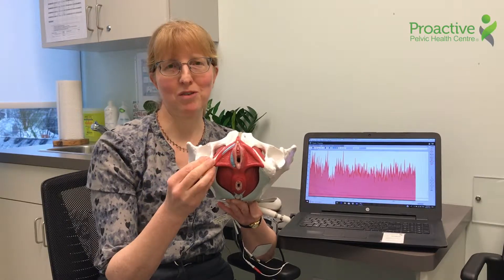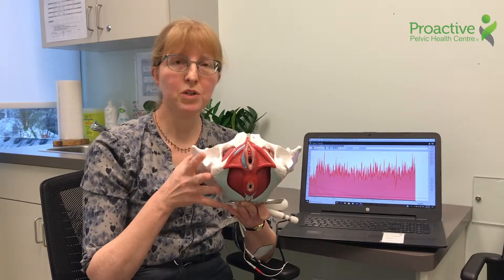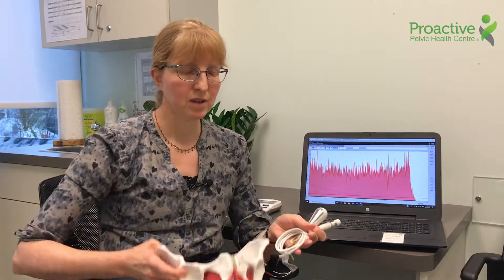How do you measure the muscles of the pelvic floor? There are three different ways we measure them. We do have little sticky electrodes — they're a little bit smaller than the ones on my forearm — but you can stick those on the outside on the skin. It's not quite as accurate, but it's more comfortable for some people.